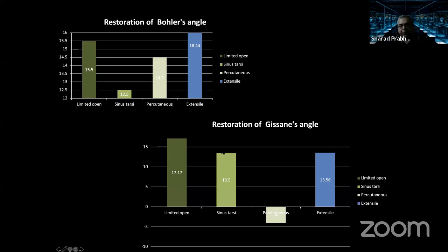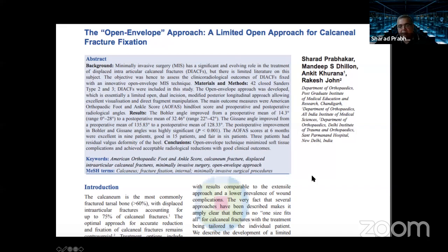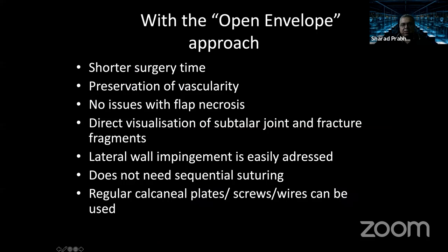And when we compared limited open to extensile approach, we found that they were comparable. We published this in IJO. So this is not a one pill for everything. This is only one of the approaches for calcaneus fractures.